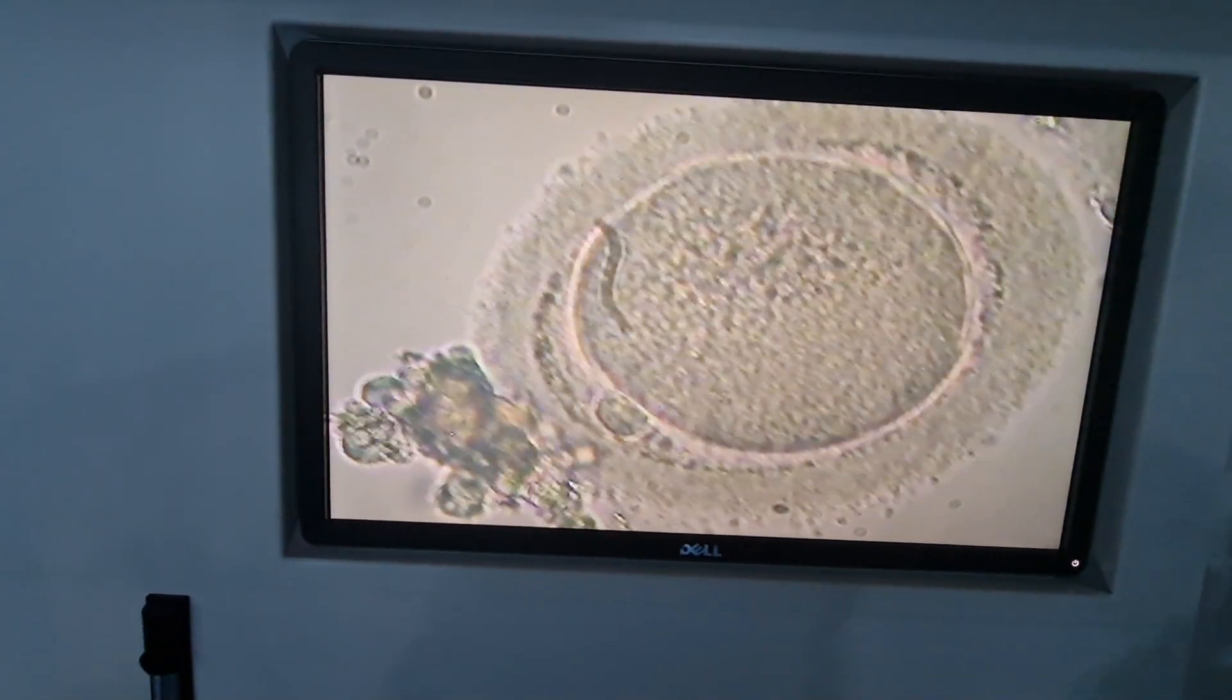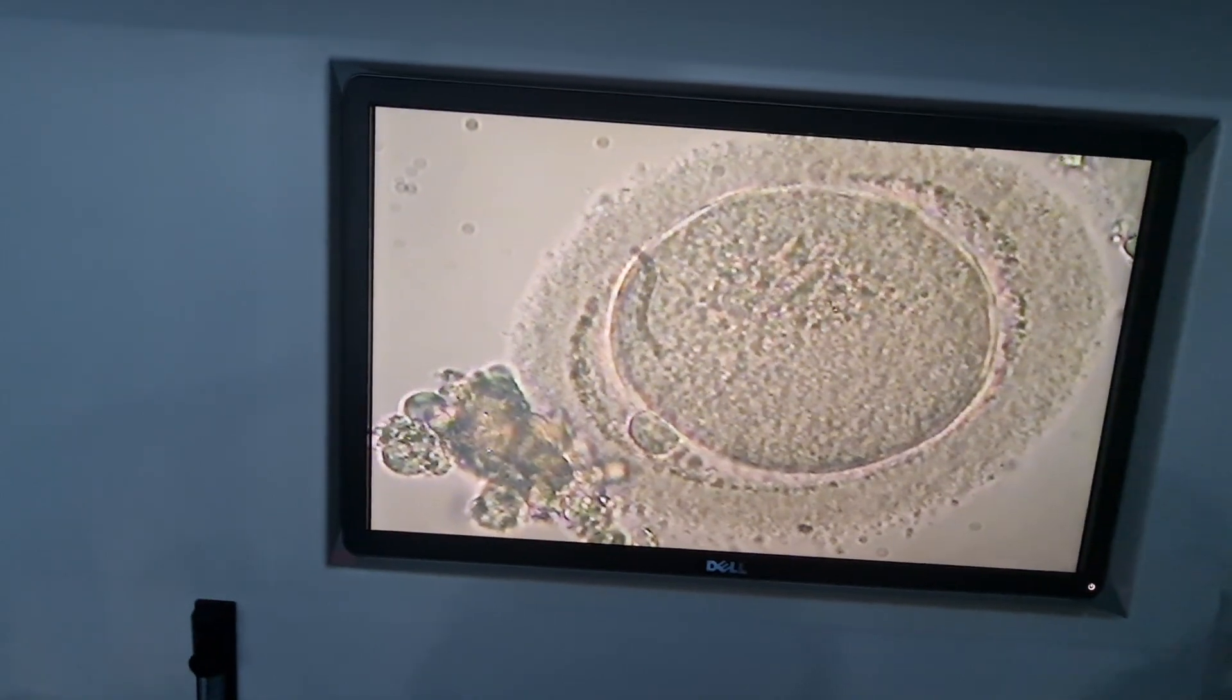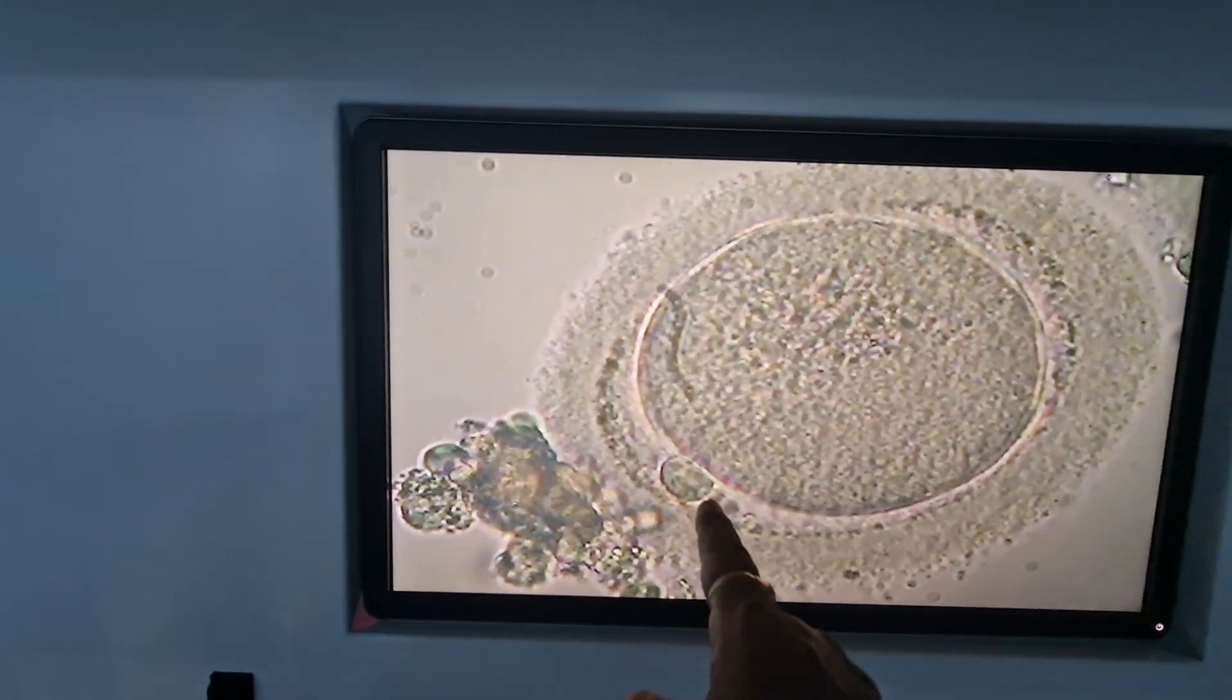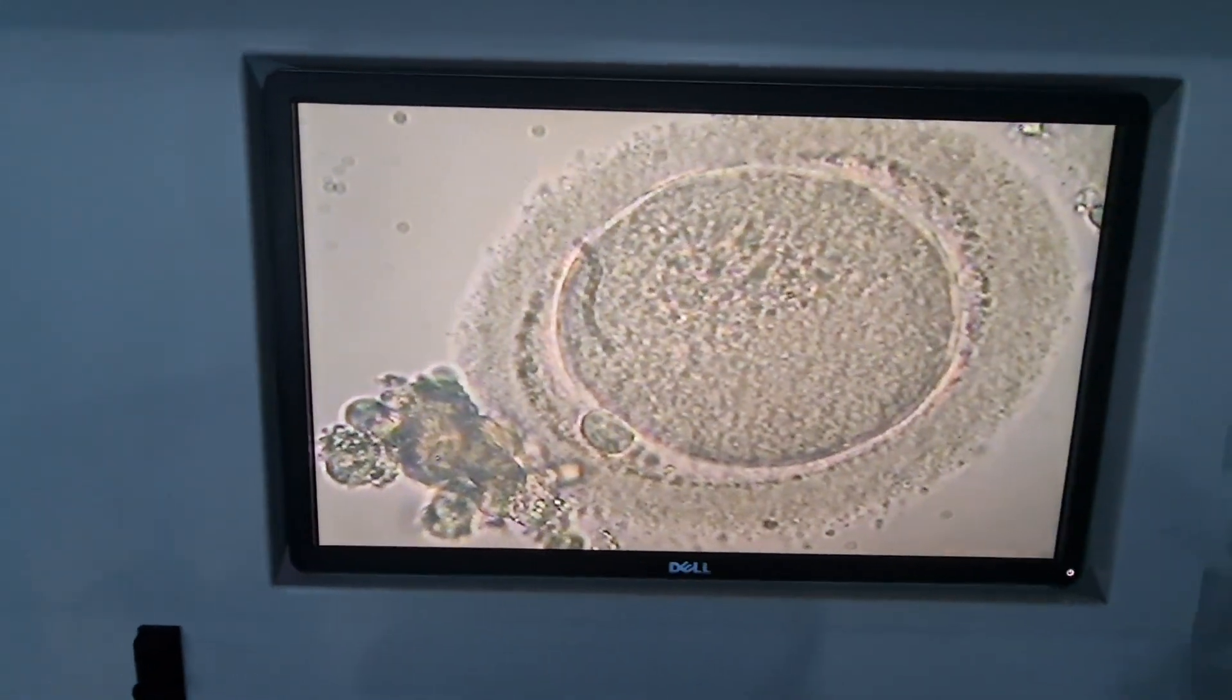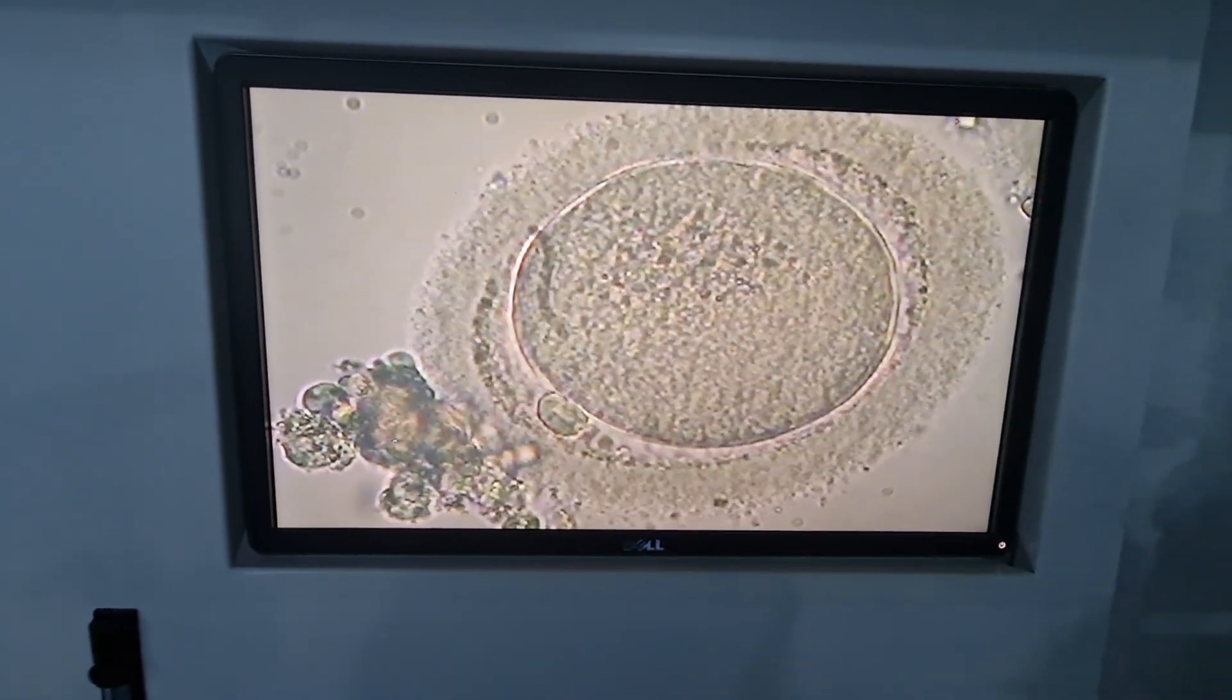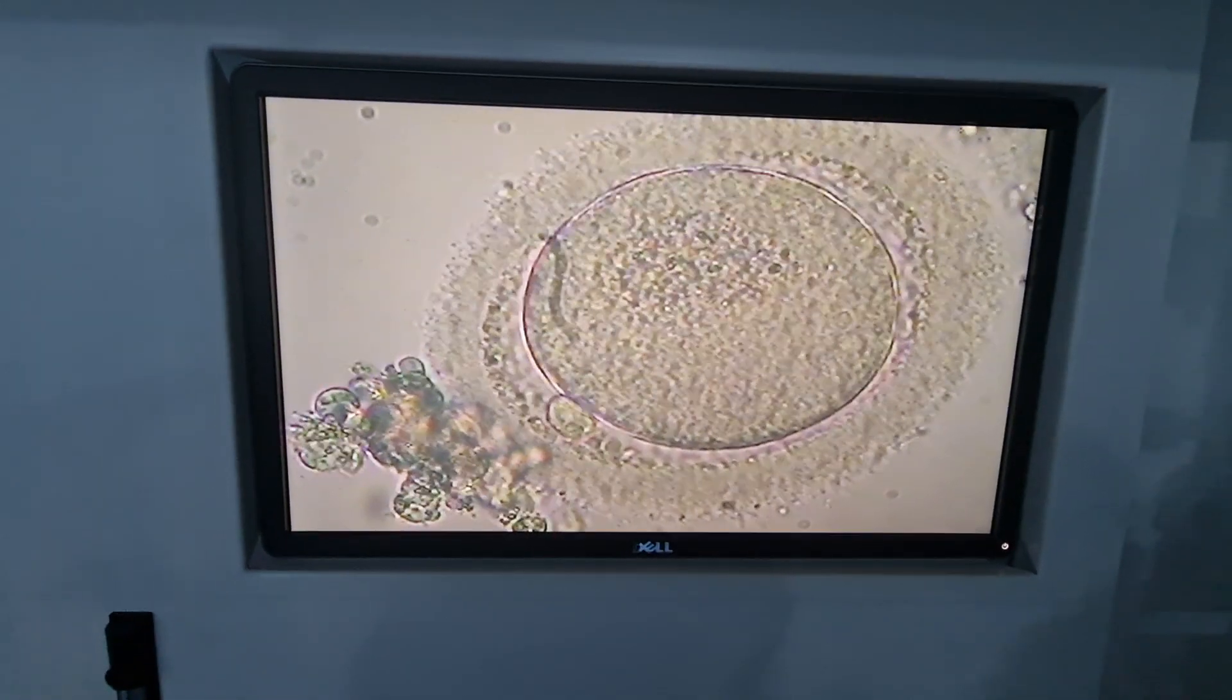This is a mature human oocyte. We can see a single polar body at 7 to 8 o'clock, with thick zona and perivitelline space. We can see the oocyte without any nucleus.